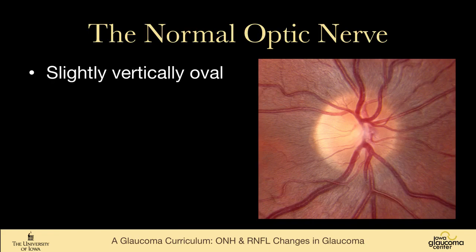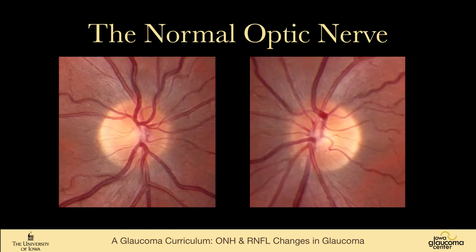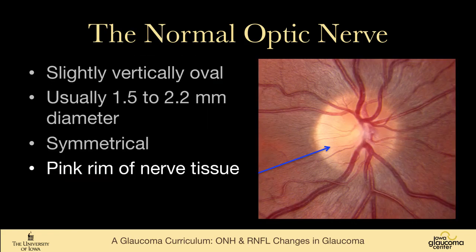So the normal optic nerve is slightly vertically oval. It's usually 1.5 to 2.2 millimeters in diameter. The nerves are typically symmetrical, like in this patient. There's a nice pink healthy rim of nerve tissue, and then there's a center excavation called the cup.